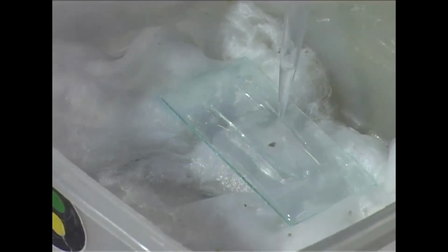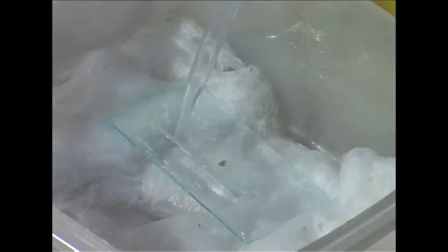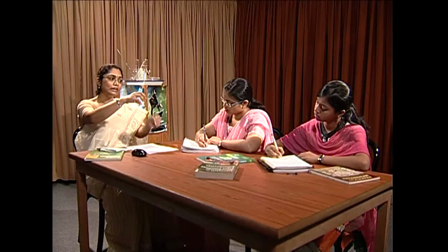Suppose the sample you have loaded carries two antigens, A and B. We don't know their presence, but we want to find out whether a given sample or blood serum is carrying A antigen, or A and B antigens. Then what do we have to do? We have to add anti-A antiserum in one trough and anti-B antiserum in the other trough. If the antigens are present in the serum, after their separation they will diffuse. At the same time, the antibodies will diffuse from the troughs and they will form precipitin lines.